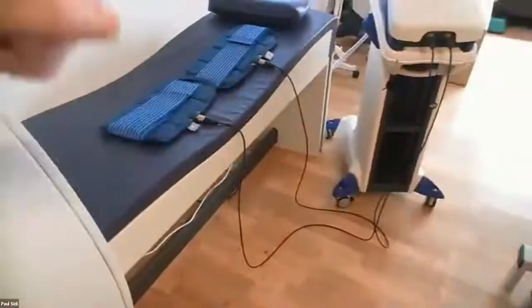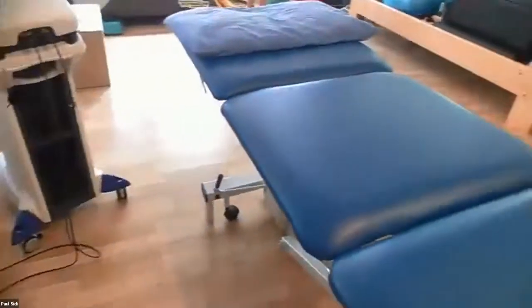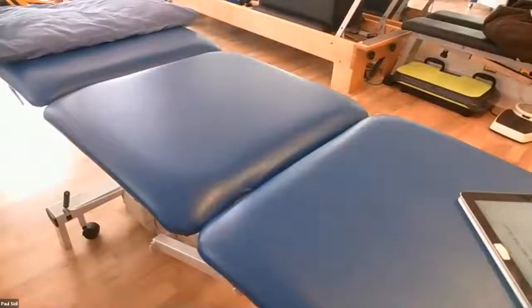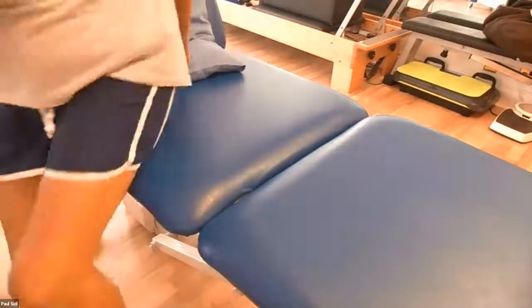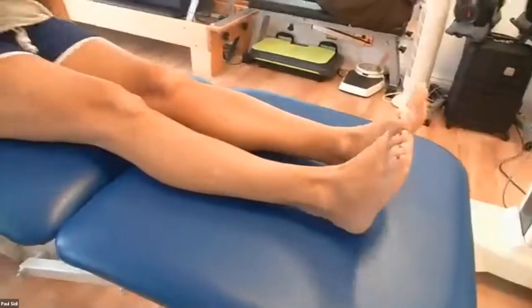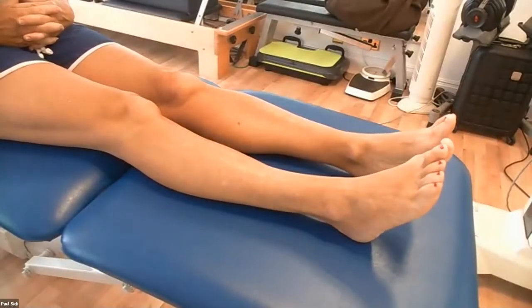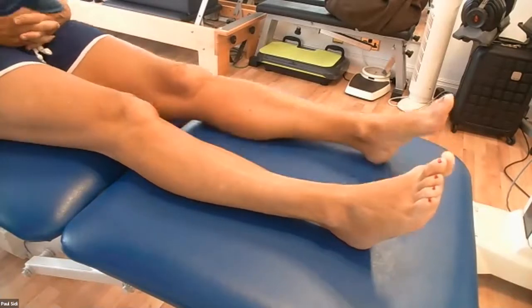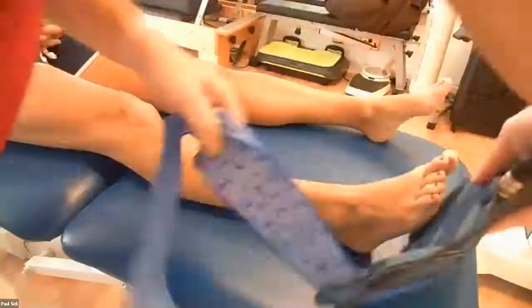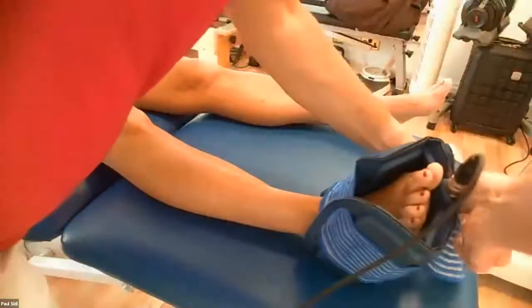I'll set up for the flexi pads, then I'll show you how this would work, the bed, but then we'll go into the laser. So, just in case anybody's wondering about this, my model is my wife, so that's why we're not covered in PPE and the various products you get. Okay, let's say the sesamoiditis is just on this right foot. I'll get this round the foot here. I'm going to run that round there.